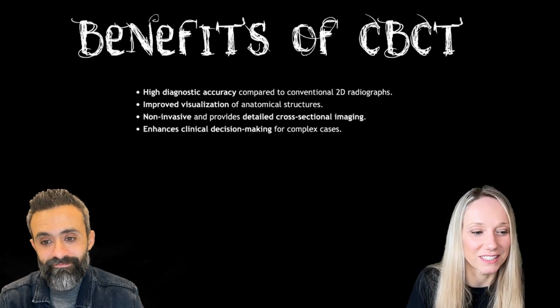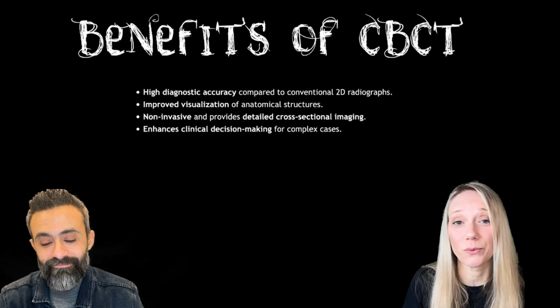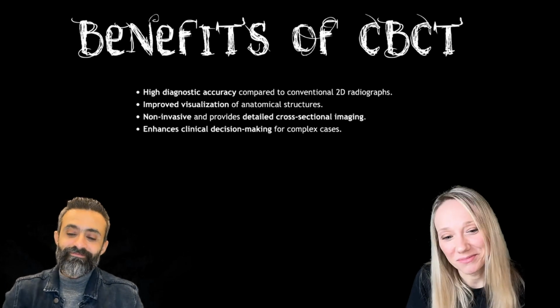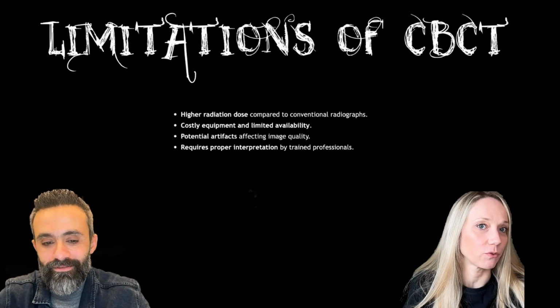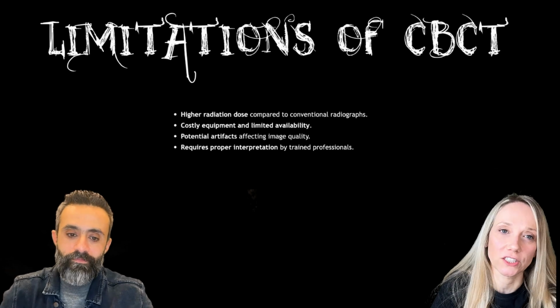And so I think this is one of the most important things in our practice, because at the end of the day we are treating patients and trying to provide them with the best treatment. And so the more information we have, the better we can work. That's it. Talking about limitations of CBCT, we said it before. Of course, it gives the patient more radiation than a conventional X-ray.